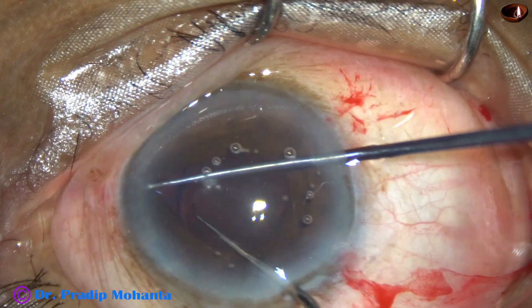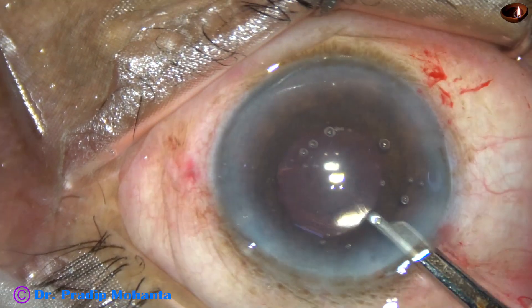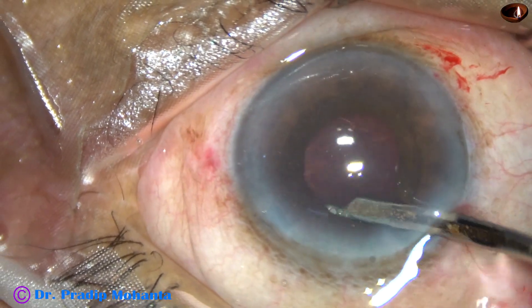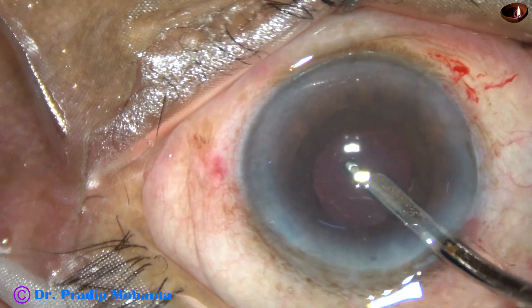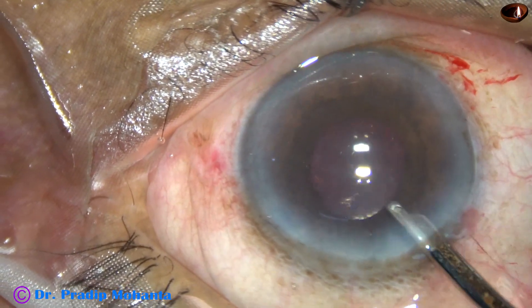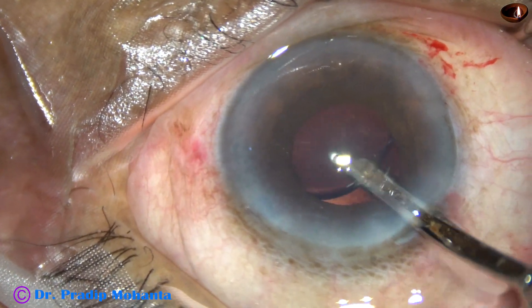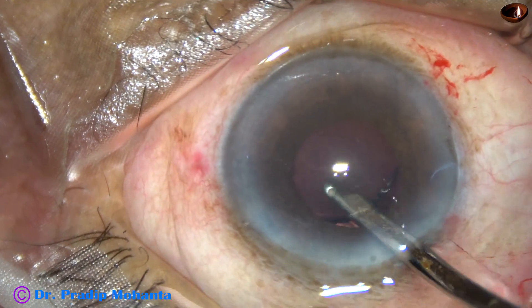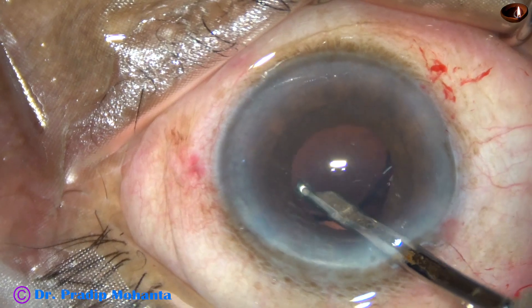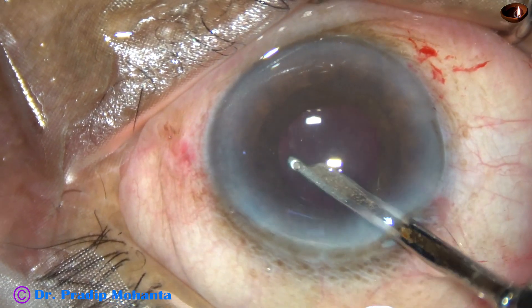This is done. Because the iris has been touched so many times, the pupil has become really small, but it doesn't matter now — we have finished our job. The visco from the anterior chamber is removed. We go behind and irrigate the capsular bag, removing most of the visco by irrigation and later by irrigation and aspiration.